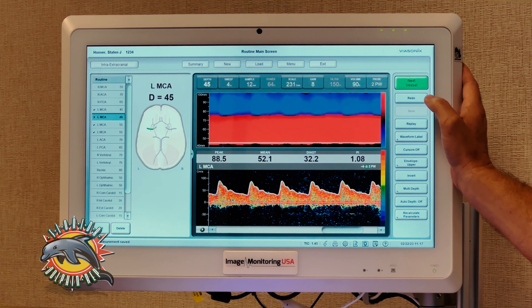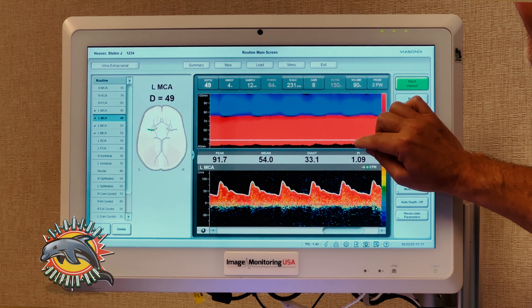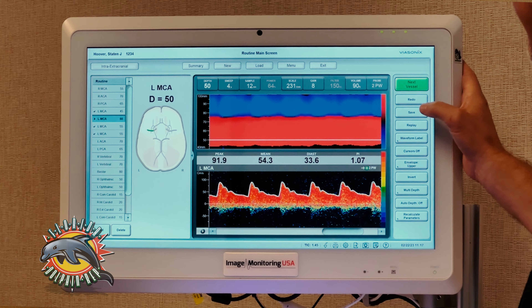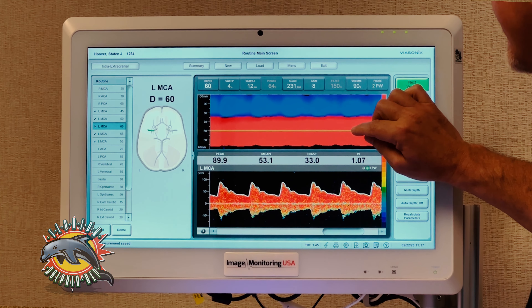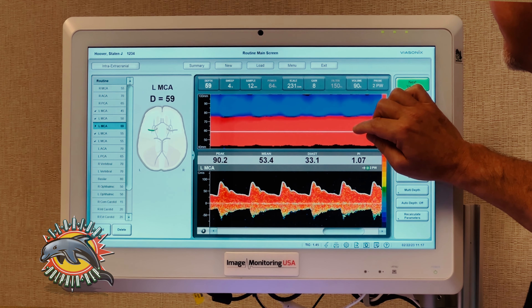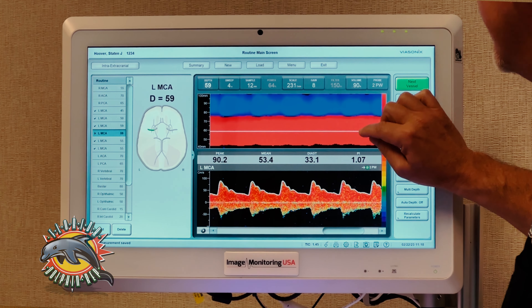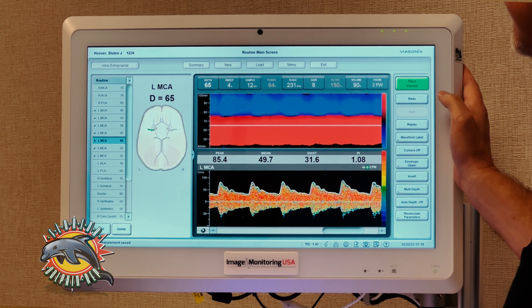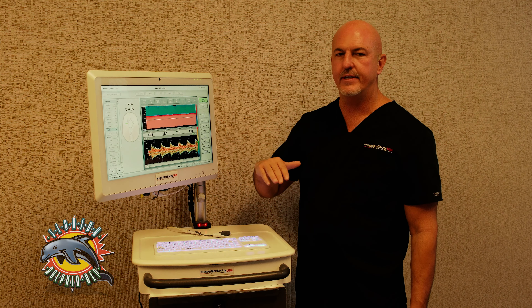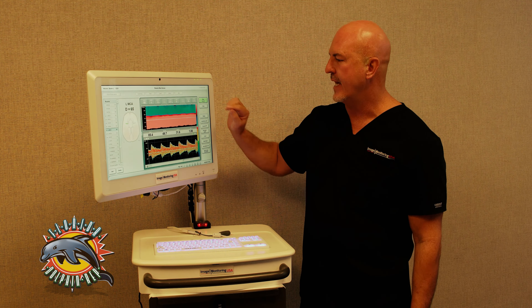If I want to walk down to 45, I can save my depth at 45 without re-scanning. I can come up to 50 and save that scan. I already have it at 55, so I can walk it up to 60 and save that scan, then come up to 65 and save that scan. Just look at all the different multiple depths I got with that one scan.